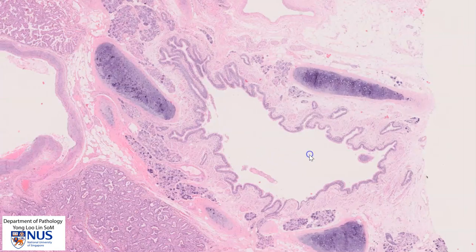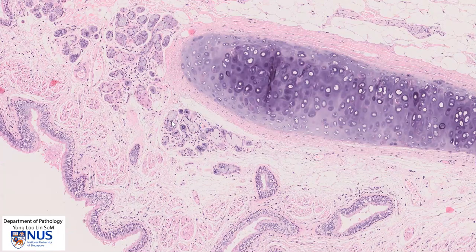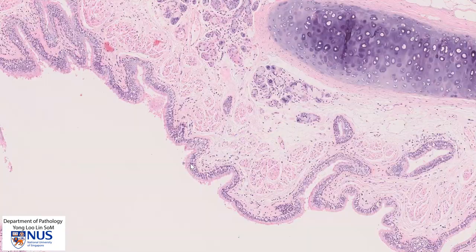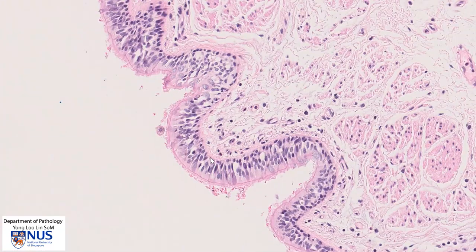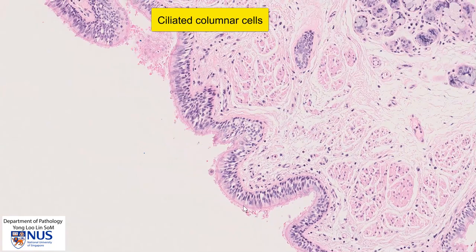Here is the bronchus, and we can see the bronchial cartilage, in which the chondrocytes sit inside lacunae within this blue-gray myxoid stroma. We have the peribronchial glands here, which include mucus glands, and some of these granular bluer ones are serous glands — so seromucinous glands. We also have the bronchial epithelium and the lumen, which is lined by pseudostratified columnar cells. If you look carefully, you can see the cilia — these are ciliated columnar cells.